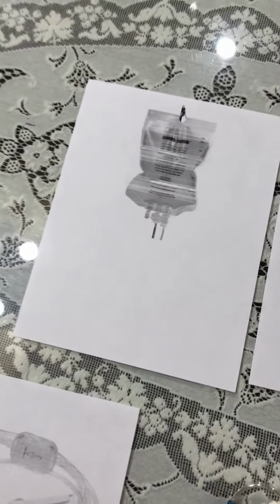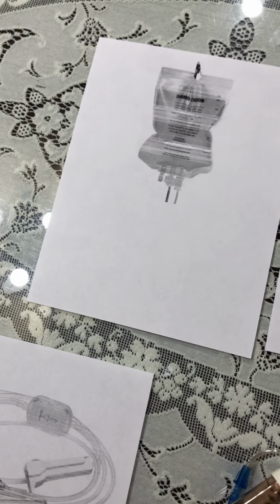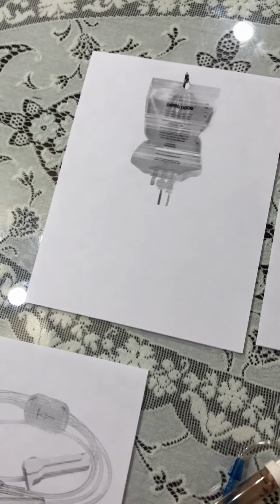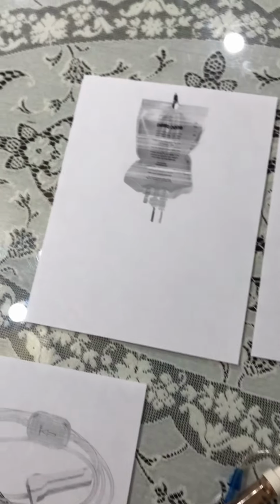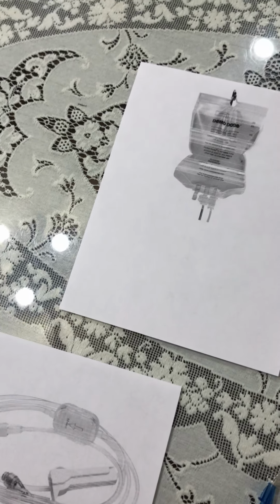Same thing for my TPN solution. I need to verify for any layering or turbidity or precipitates, because that can indicate that the bag is no good and bacteria has gotten in it, and I need to send it back to pharmacy to get a new one. I also need to check my TPN solution and verify that the solution and additives match the doctor's orders.